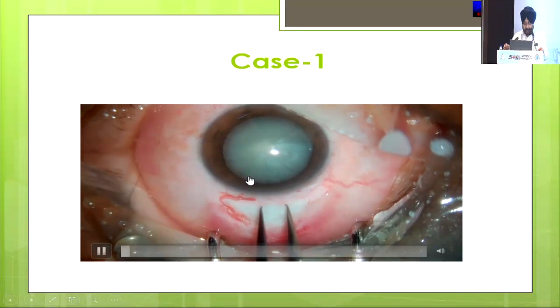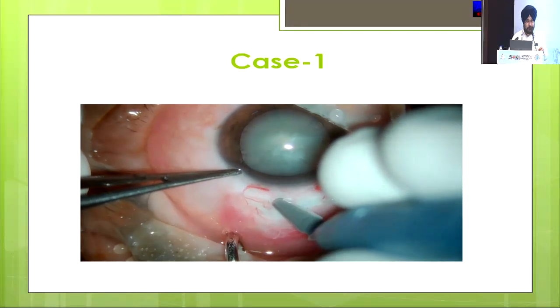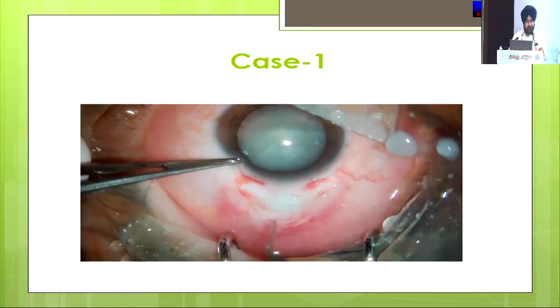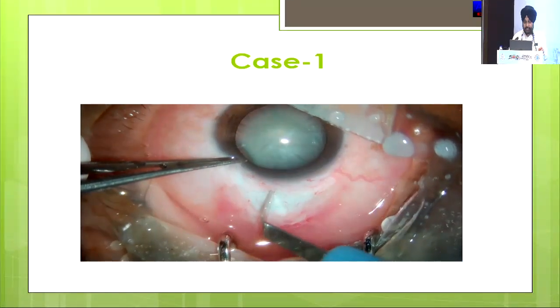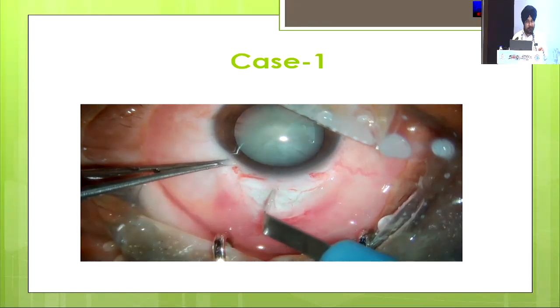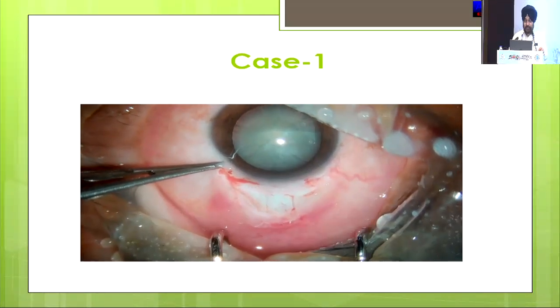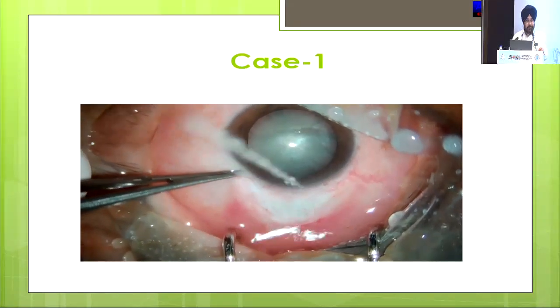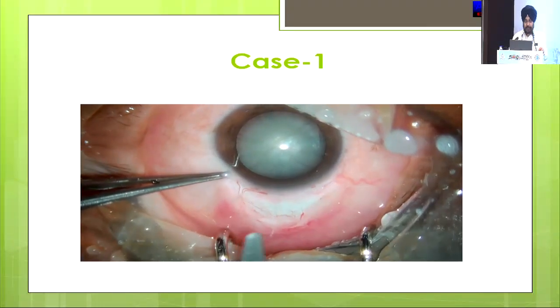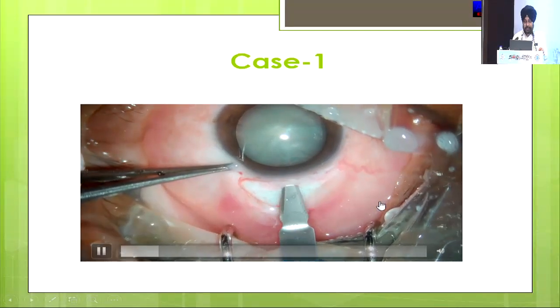As Dr. Sahu described, my incision is approximately 1.5mm behind the limbus and it is 2mm. The first scleral pocket is 2mm, then approximately 1.5mm to 2mm towards the fornix. Practically the inner incision will be at that point and the outer incision will be 2mm. Then we proceed to dissection of the scleral pocket.